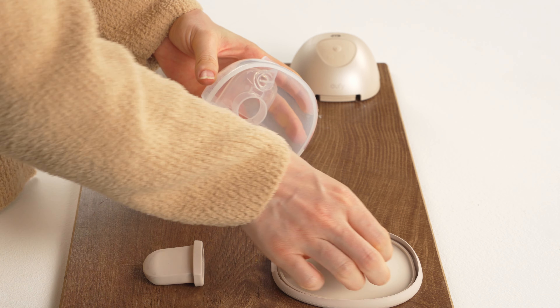Push the flange onto the container, making sure the heating pins are fully inserted into the oval notch. Wrap the outer ring to ensure it is properly sealed to prevent milk leakage.